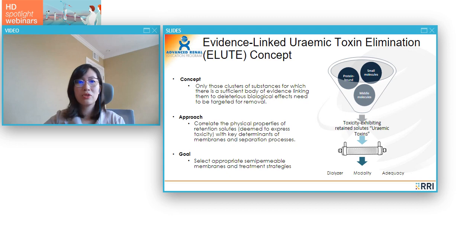Now, I want to introduce a concept we proposed, called the evidence-linked uremic toxin elimination approach. This is the concept we published in an article in CKJ.